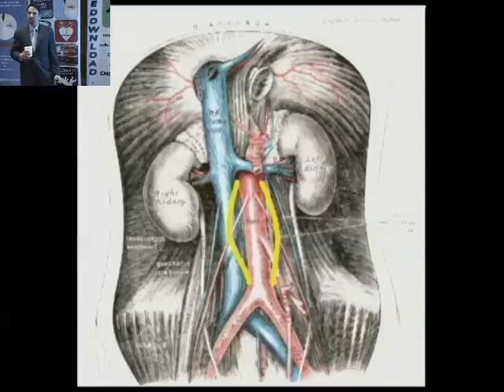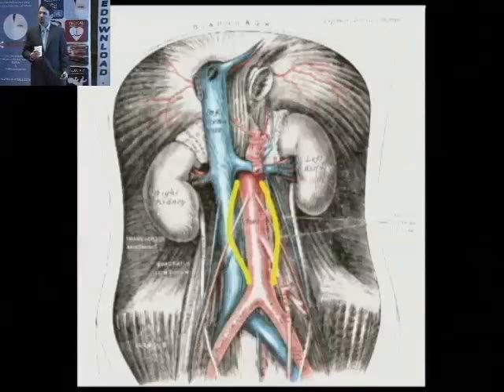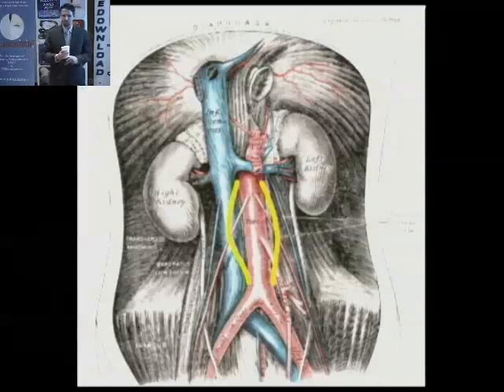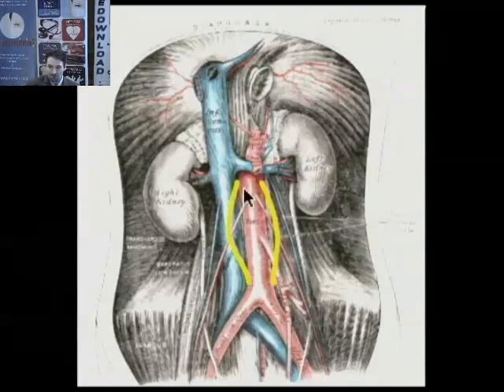Let's talk about some anatomy. This is just a general review. There's not too much involved with the anatomy of the aorta. It's basically a hollow tube that conveys blood from point A to point B. This is just the intra-abdominal portion. It's a retroperitoneal organ. All the intraperitoneal stuff has been stripped off for the purposes of this slide. You can see, let me just move the pointer here. If I get in your way, just let me know. I'm going to try to crouch down.